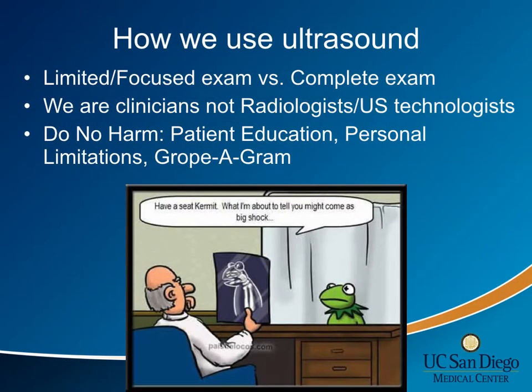All of that said, it is important to be mindful of our limitations as well. Remember, we are doing limited exams to help answer a specific clinical question. This is not a formal radiology study, and as with all skills, you should be mindful of your own level of experience and do what is best for the patient.